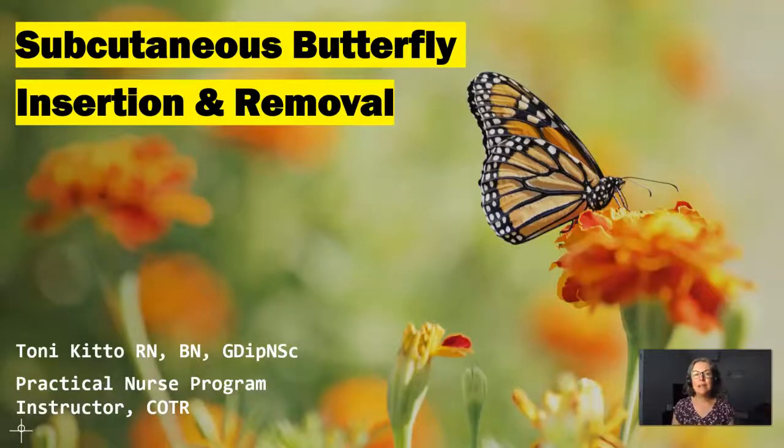Subcutaneous butterfly insertion and removal procedures. For this demonstration I will be using the BD Safety T Intima 24 gauge single port subcutaneous indwelling device. I will also be demonstrating medication administration, however you can use this type of butterfly for hypodermoclysis as well. Let's get started.